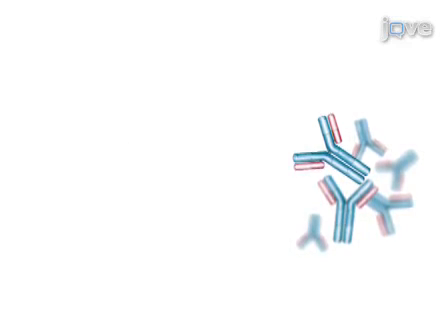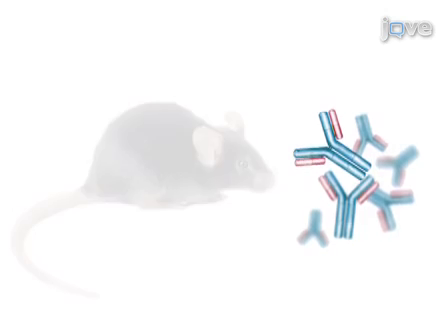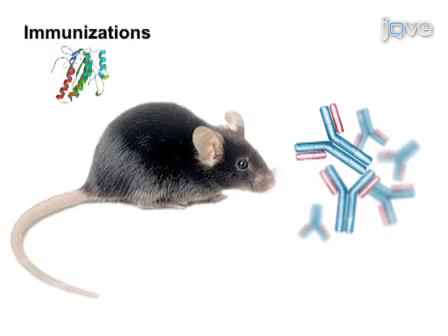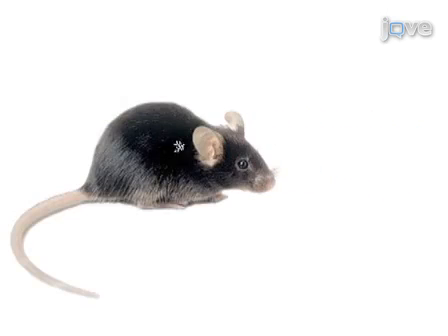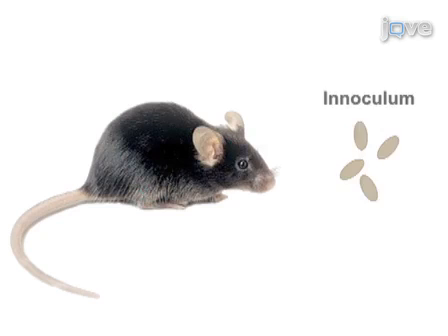The second step of the procedure is to administer the selected monoclonal antibodies intraperitoneally 2 hours prior to the intranasal infection, in order for these molecules to have time to distribute throughout the body. The third step of the procedure is to anesthetize the mice and intranasally infect them with the desired inoculum. The final step of the procedure is to monitor the health of the animals.